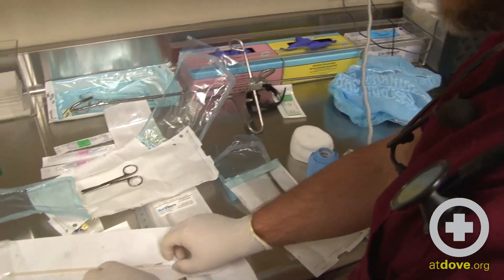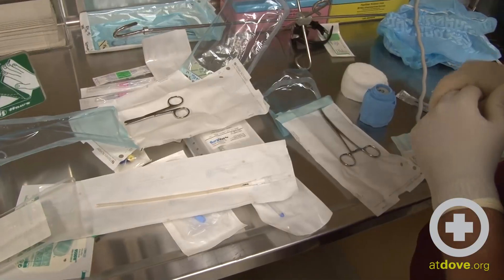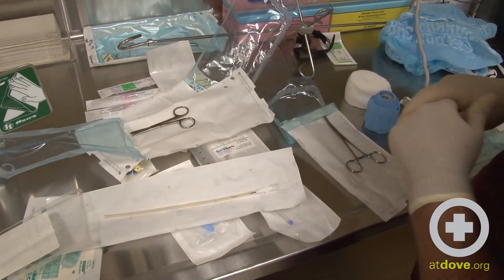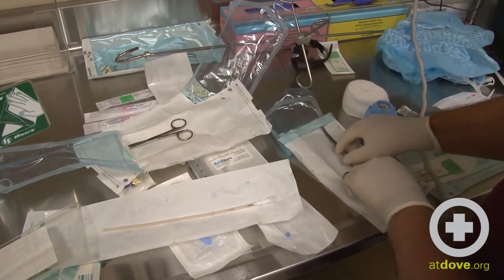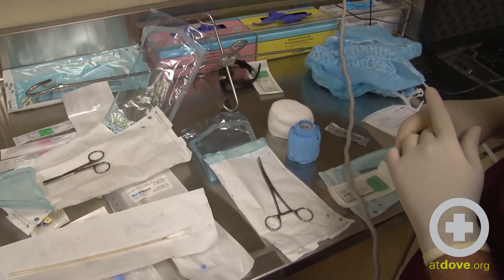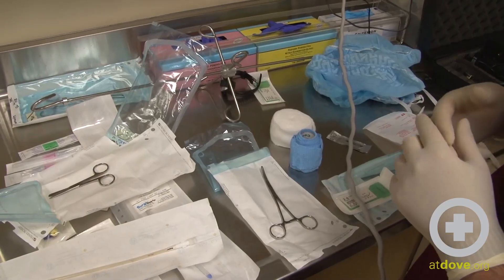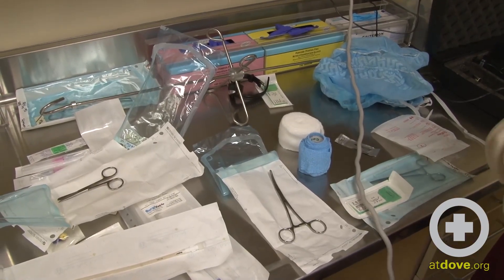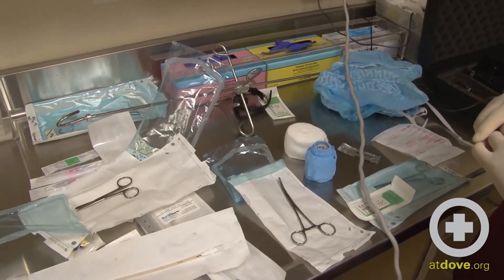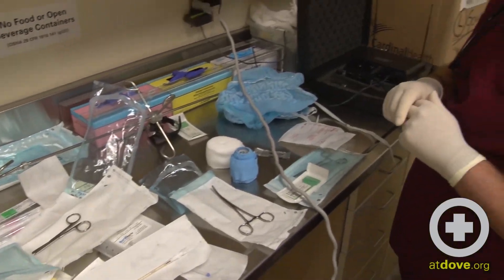Here we have our esophagostomy tube. It's a fairly soft tube, which is good for placement, and we can actually leave it in place for fairly long periods of time. We always want to make sure we cut off the tip so it does not get clogged. We also have our curved forceps, which allow for cutting into the esophagus and pulling the tube through the skin, along with suture material for placing a finger trap to secure the tube, and needle drivers for suturing.